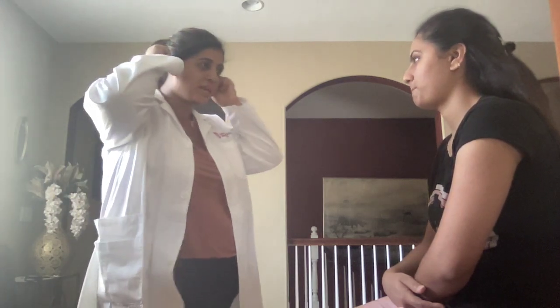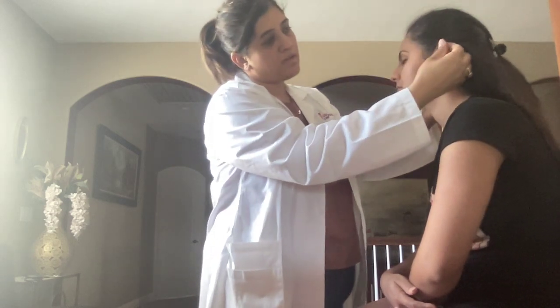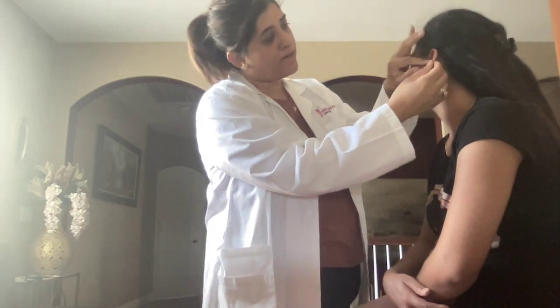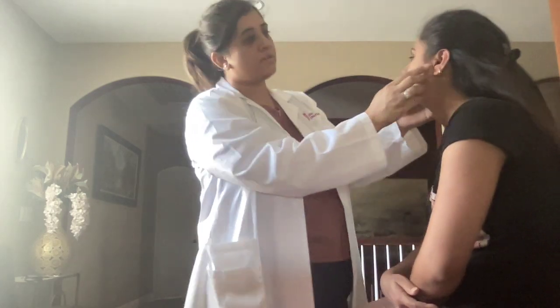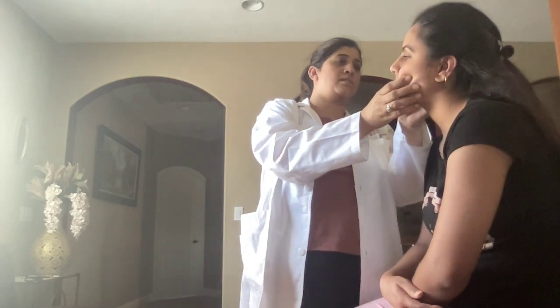Okay. I'm gonna be checking your auricles. The ears are symmetrical. The auricles have no exudate, no redness, no drainage on the external ear. And I'm going to do the tug test. Do you feel any pain? No. No, on this side. No. Okay. Now I'm going to be checking your internal canal.